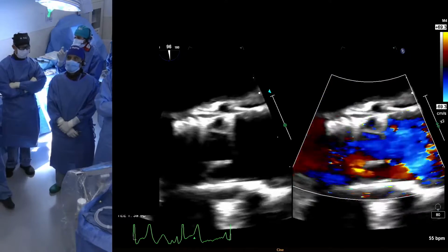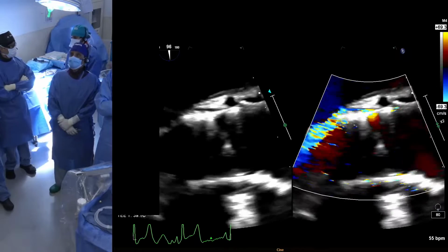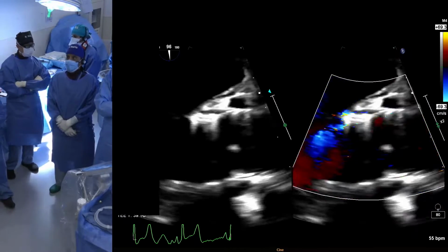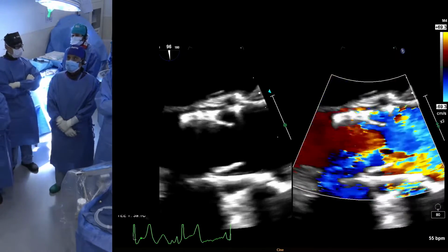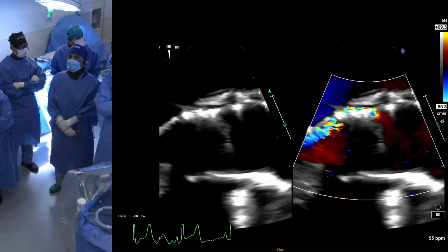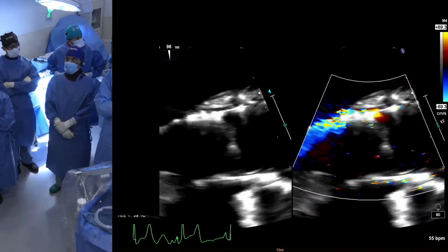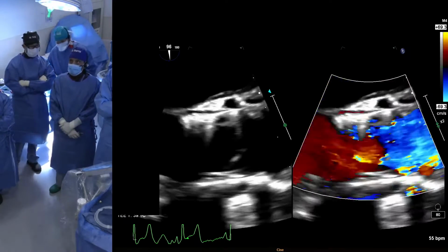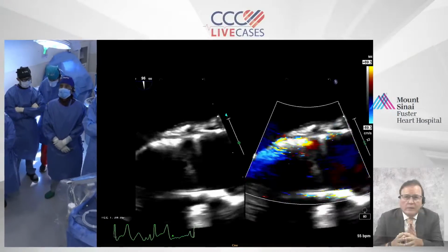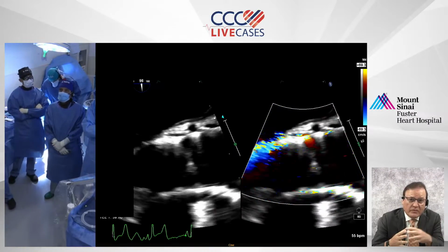Should we have placed it lower? That's a very good question. It's probably going to make the intervention harder now. You're right. So we'll show the CT. I think it is so interesting, and a lot of time and effort has to be put, I mean, attention put into the first procedure. Yes, because we know they're going to come back to us at some time. And also Navitor wasn't available back then. Correct.